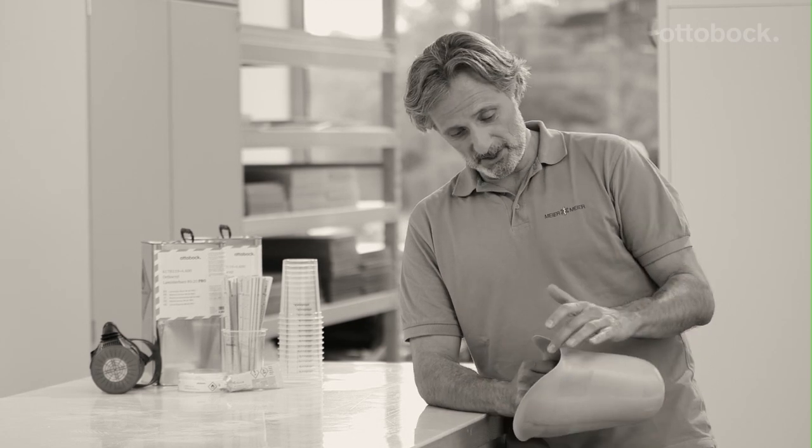When colleagues ask me why I like 8020 Pro so much, I just show them the results of my work as an answer — sockets with surprisingly thin walls, and nevertheless as strong as those made with more viscous resins. This is exactly what I consider the highest quality in the workshop.